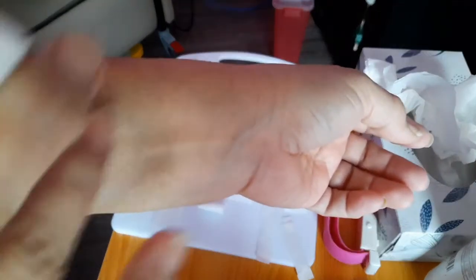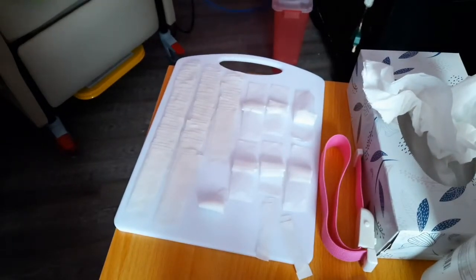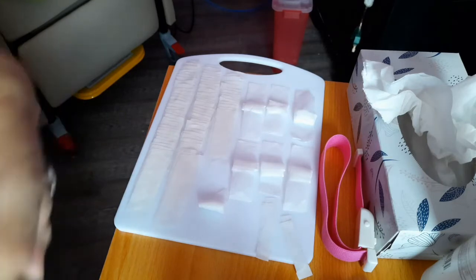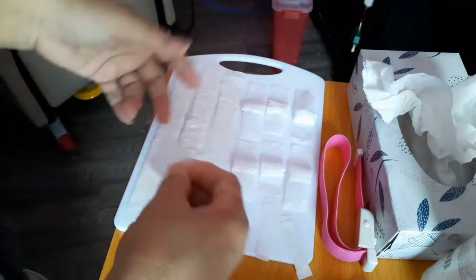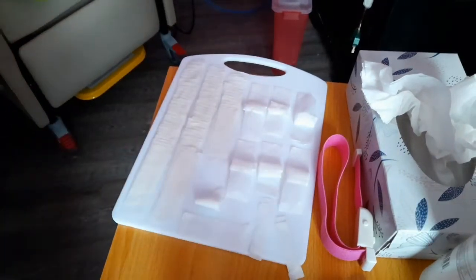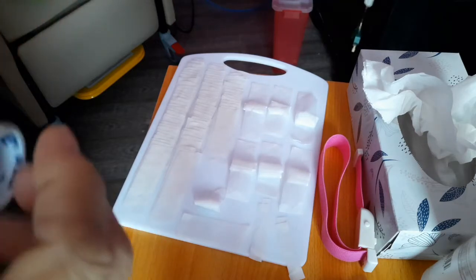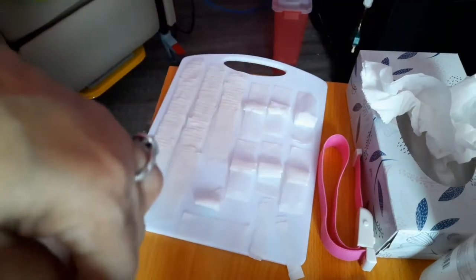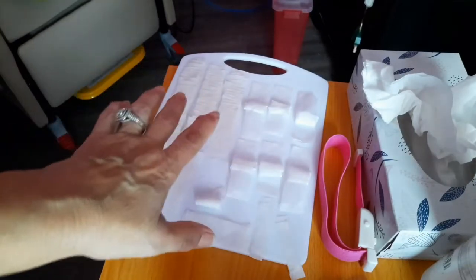Now, I like to secure my lines once the syringes are in, so I tape the venous and the arterial lines on my wrist. So that's simple. You just take 2 strips, and just line it up. All right. And that's it. So I'm prepped with that.